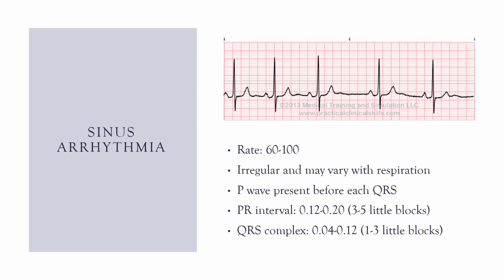Most people who take a breath in, release a breath, so it'll change with respirations. It is a normal variation with respirations for us to have an arrhythmia, okay? Also caffeine or nicotine will do this. Every time I have a cup of coffee, I end up in sinus arrhythmia. That does not mean you need to come shock me or cardiovert me. It simply means that this is a normal variation for me.